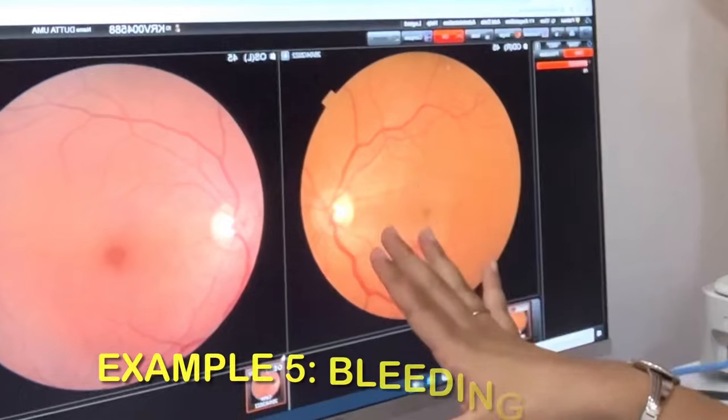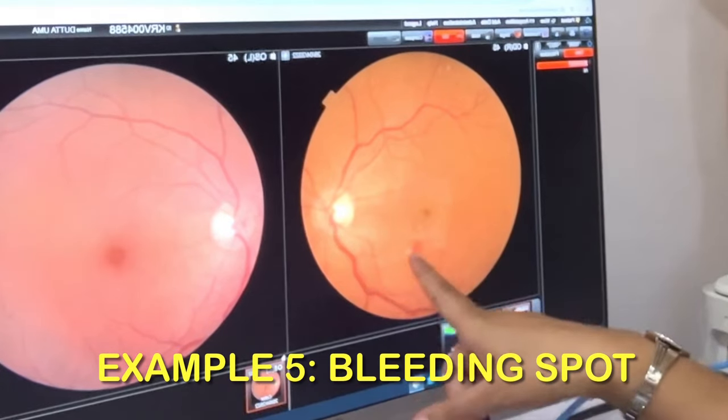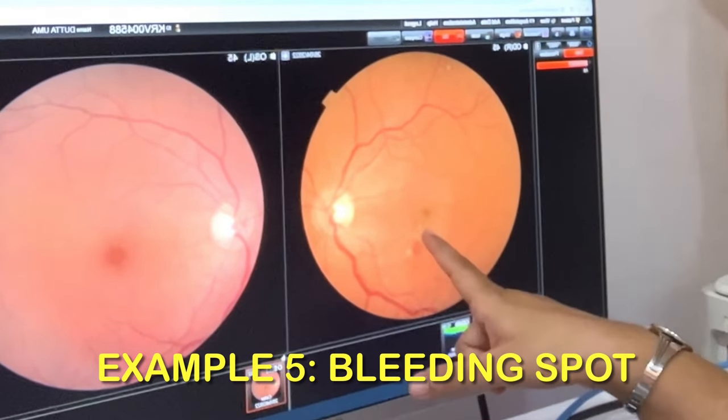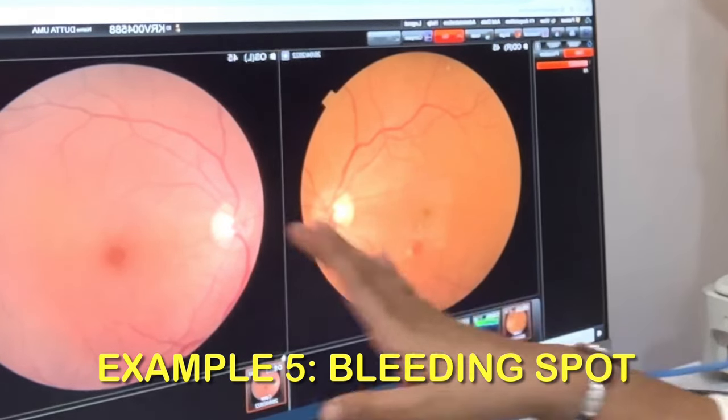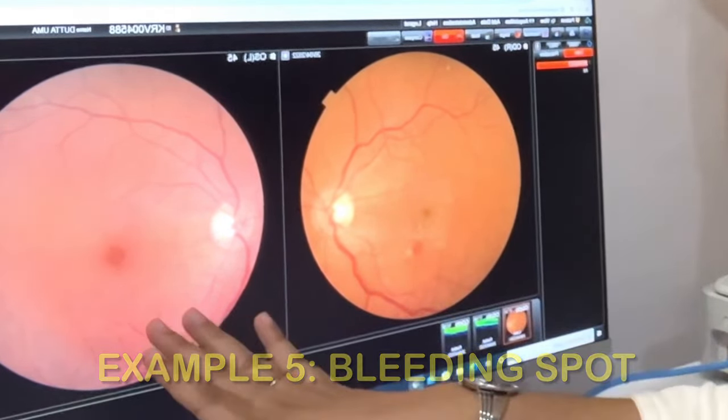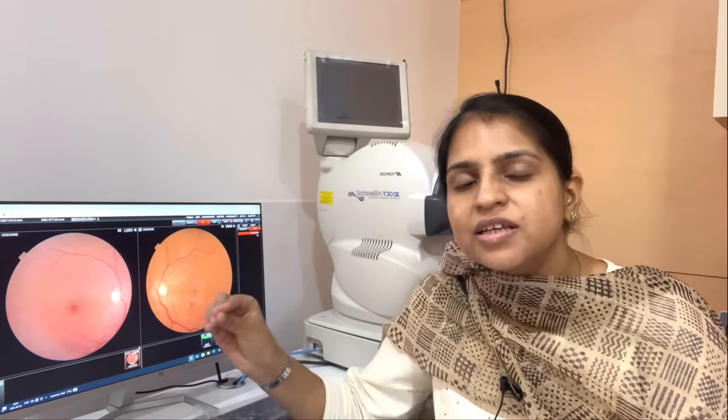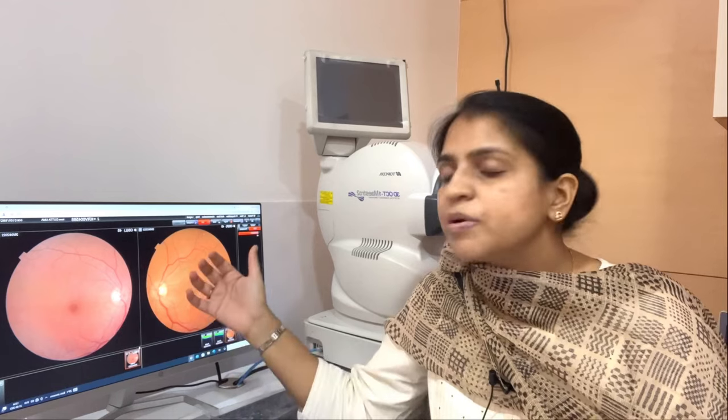As you can see in this photo, there is a bleeding spot. We are looking at the image from the machine. Here you can see very well-defined findings in this area, and in this way we can easily explain it to the patient.